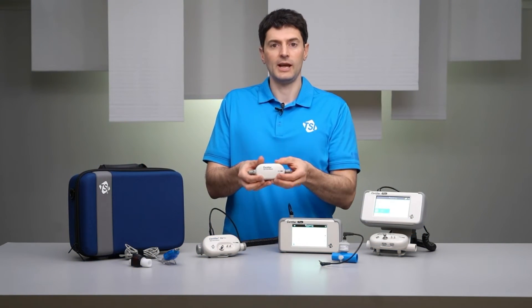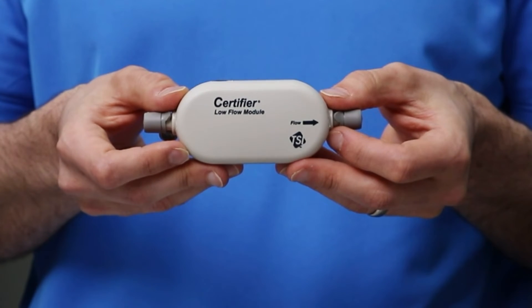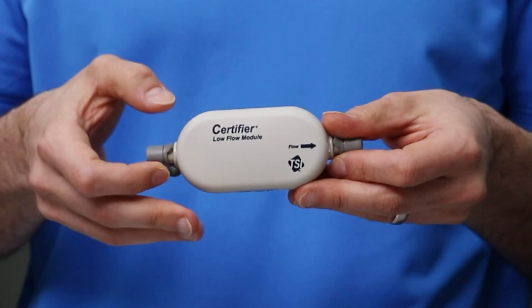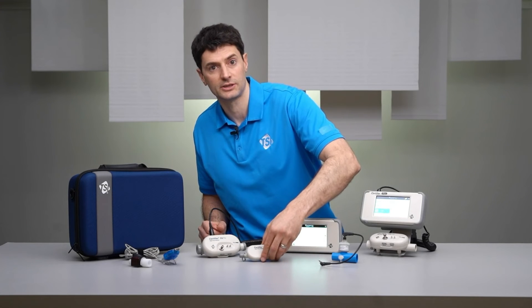The Model 4082 low flow module can measure air, oxygen, and nitrous oxide flows up to 20 liters per minute and has increased measurement accuracy at low flow rates. The low flow module is used commonly for testing nitrous oxide flows from anesthesia machines and for performing leak checks.